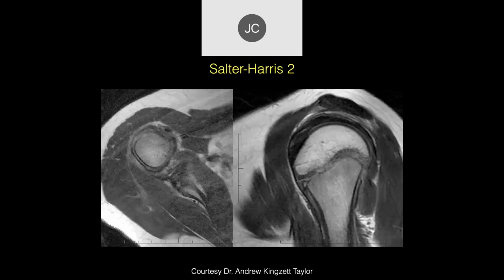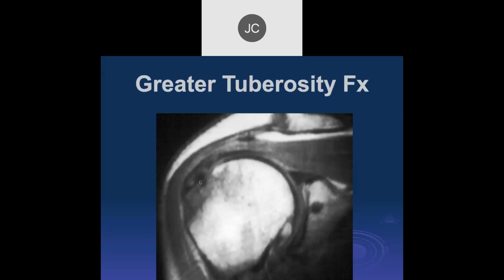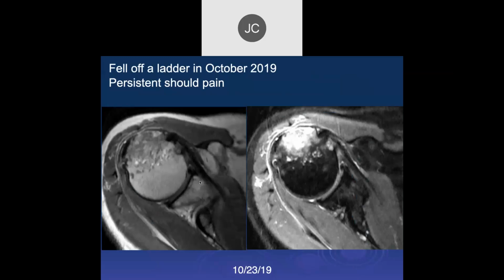So this ended up being called a Salter-Harris 2. We have a little fracture going through the metaphysis here. The treatment for these is basically a sling for 4 or 5 weeks, but no activity for a couple of months in terms of sports. Great. And here's someone who had a traction fracture, an avulsion fracture of the greater tuberosity.